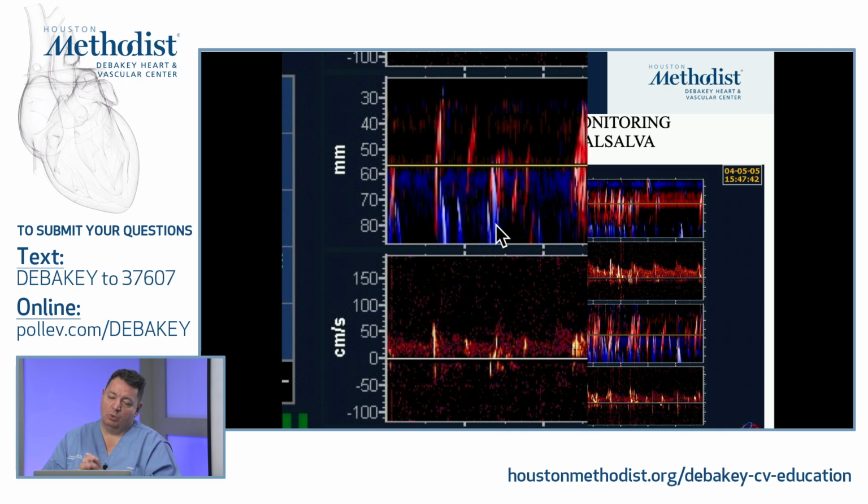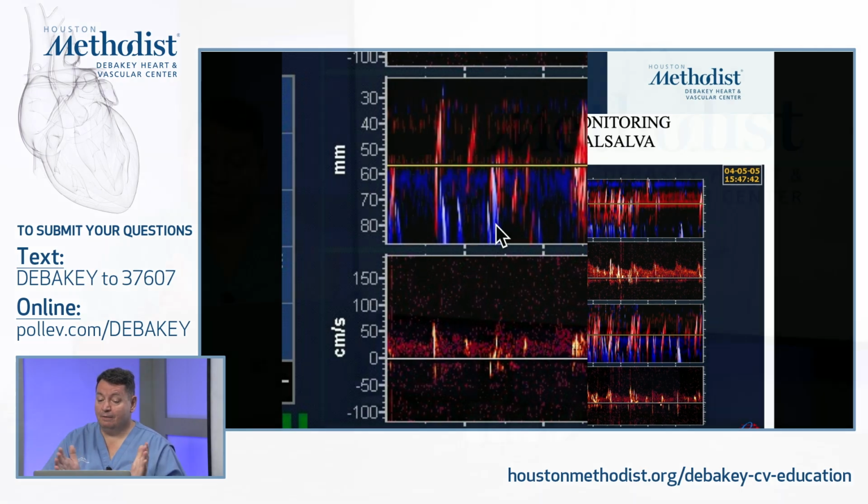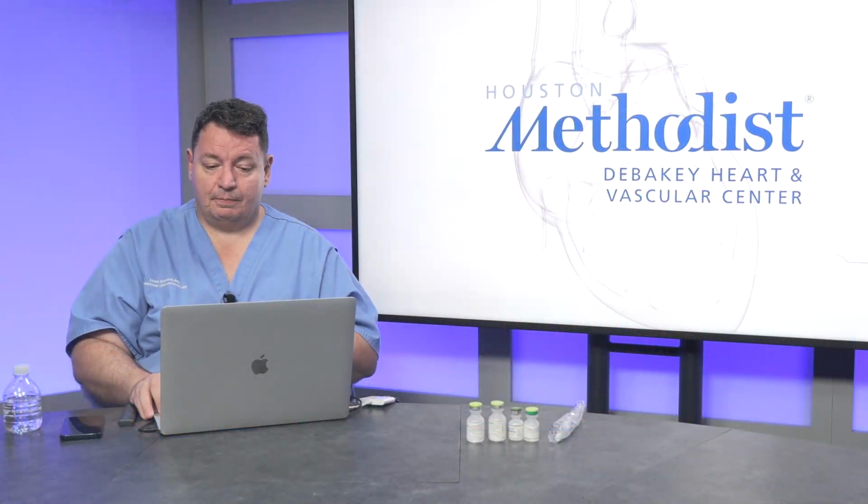So the M-mode will be the gold standard now, how we are looking at bubbles and how we are counting them. Again, you can have your cardiologist criteria of 8-10 cardiac cycles. For our international consensus, we are having a total count of 30 seconds of total emboli count. And here's how we do the test.